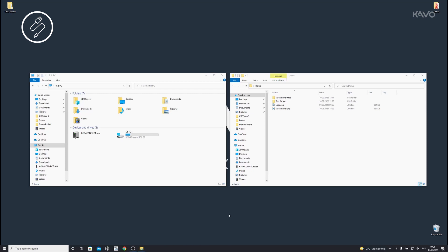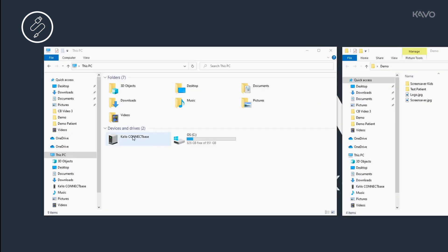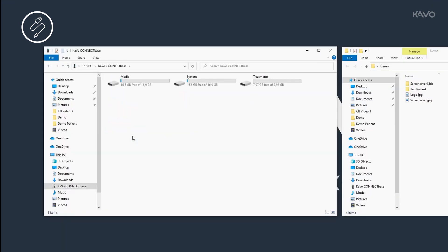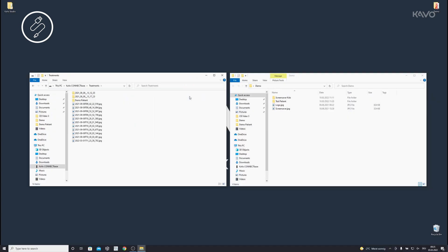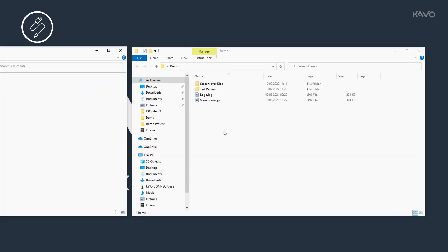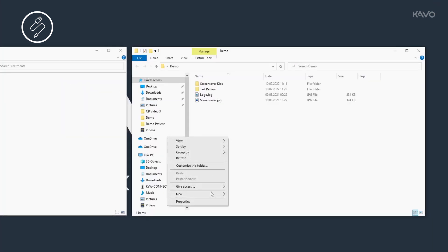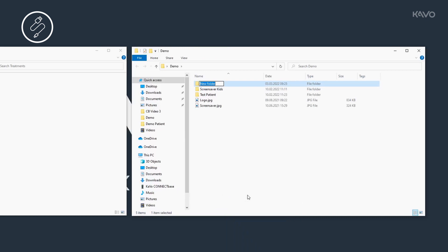If a USB cable connecting the treatment unit to the computer is active, the images taken are saved directly on the Carvo ConnectBase drive and are automatically available on the PC. Open the Carvo ConnectBase drive on the computer — the images are stored in the Treatments folder and can then be transferred to the computer, saved, and used further.